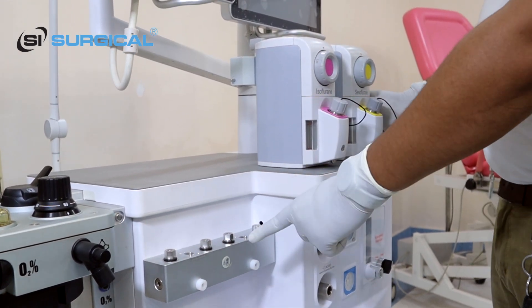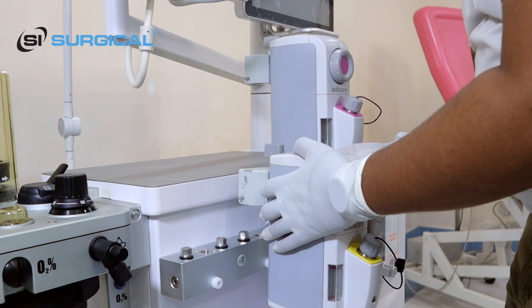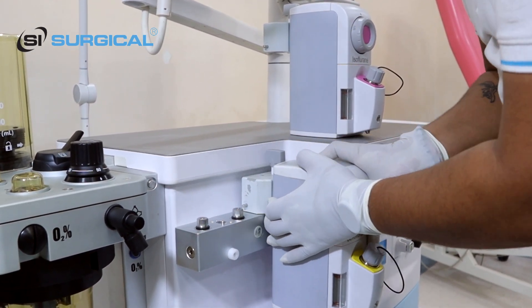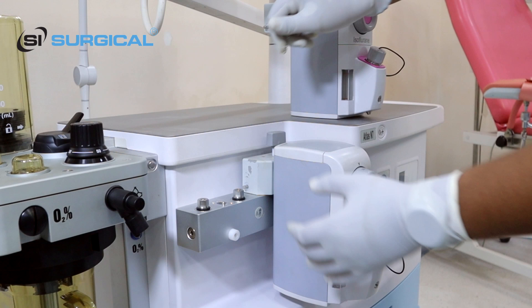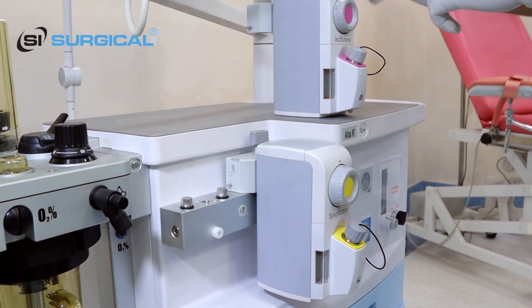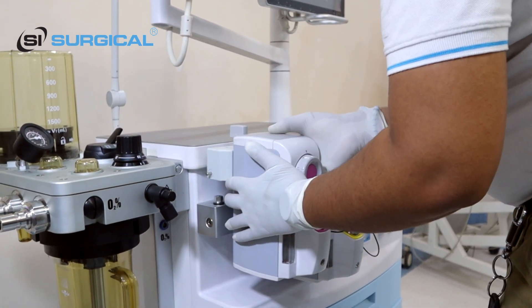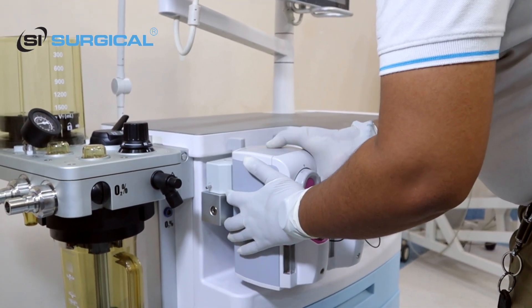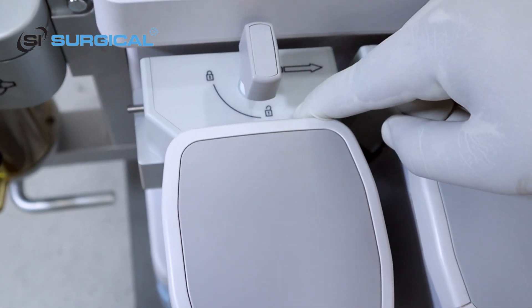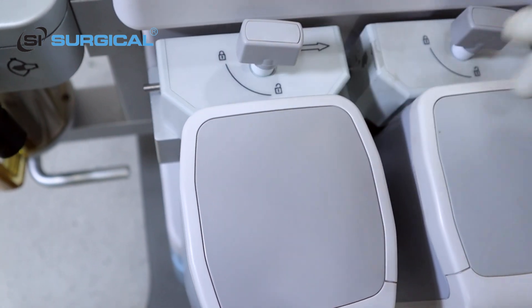We will connect the vaporizer here. This is Sevoflurane — you just place it here and set it, then lock it. The Sevo vaporizer is connected. The Isoflurane will also be connected in front of this. Just place it here and rotate — you can see it is marked unlock and lock. You just rotate it and it becomes locked.